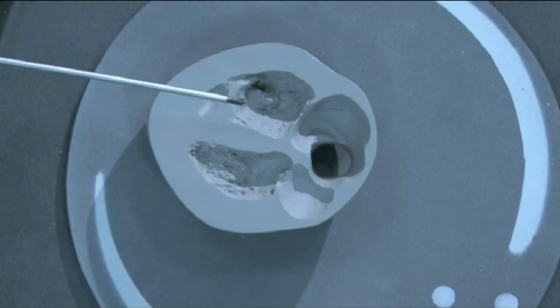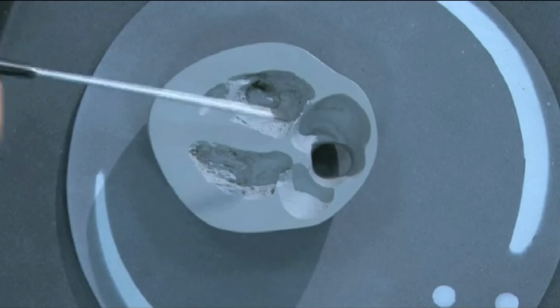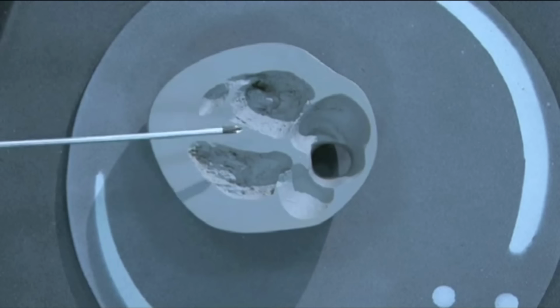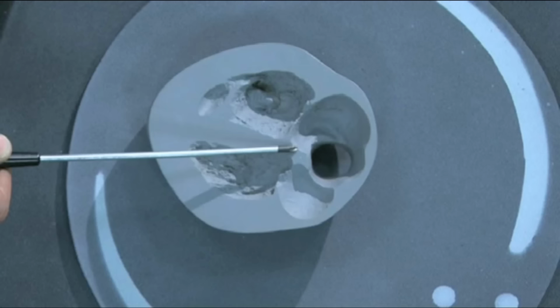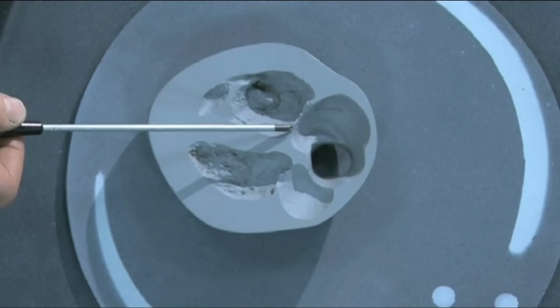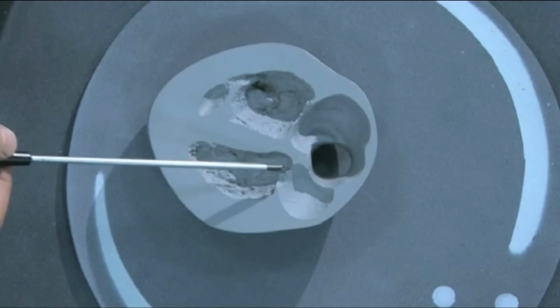Crucially, moving up the interventricular septum, the tricuspid valve comes off the interventricular septum closer to the apex than the mitral valve. This means the top of the interventricular septum runs into the atrioventricular septum. This structure here separates the right atrium from the left ventricle and is therefore the atrioventricular septum. And the way to check this is to be sure that the medial cusp of the tricuspid valve comes off the interventricular septum closer to the apex than the medial cusp of the mitral valve.